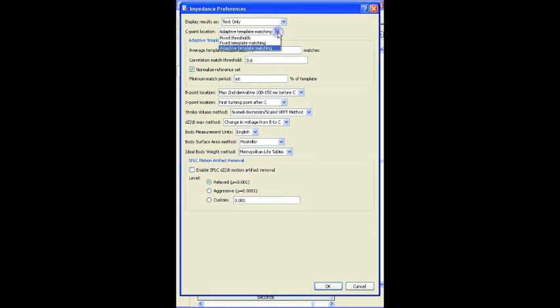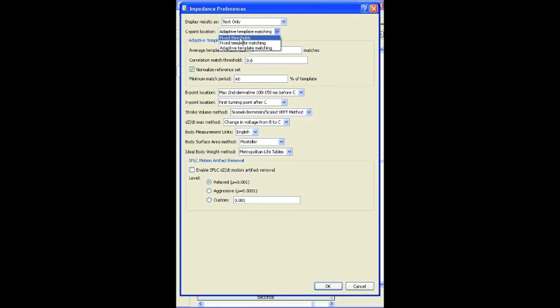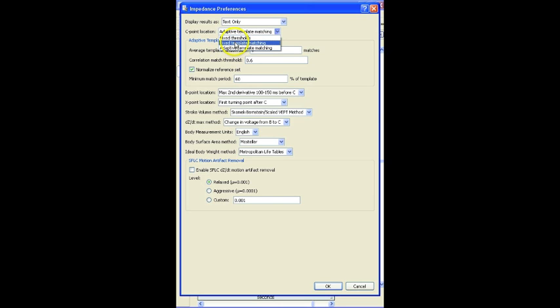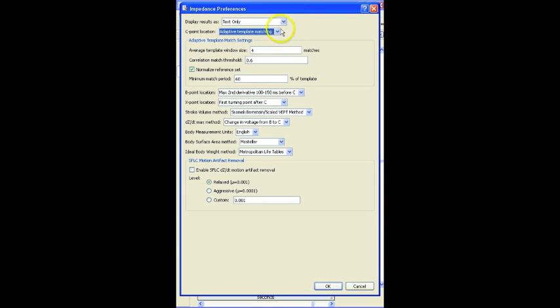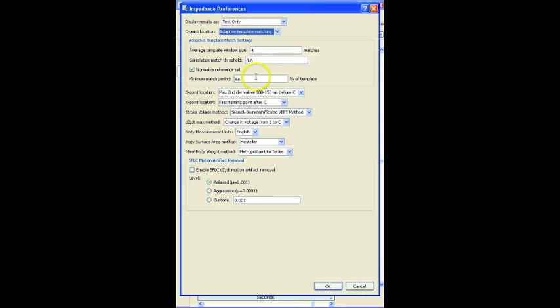The default option is an adaptive template matching method, but you can go all the way back to a fixed threshold. Now this method works well if the data is very stable and the signal isn't moving around a lot, but in most instances there's usually a little bit of movement, there's some respiratory component in there. And in order to overcome that, the template matching, either the fixed or the adaptive work a little better. The adaptive is ideal for this type of data because it's going to constantly change as the subject's signal is changing.